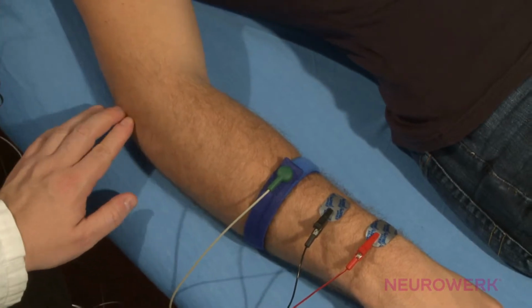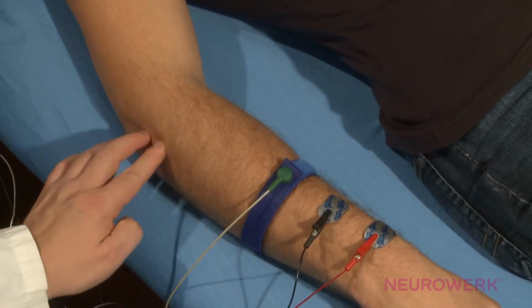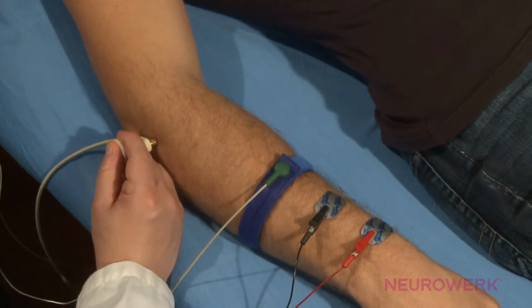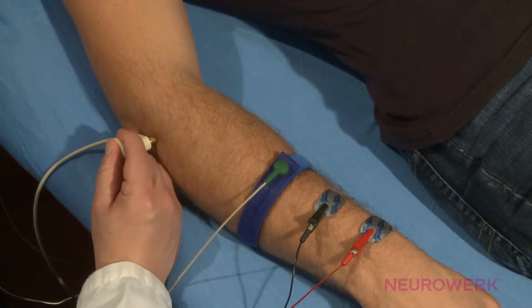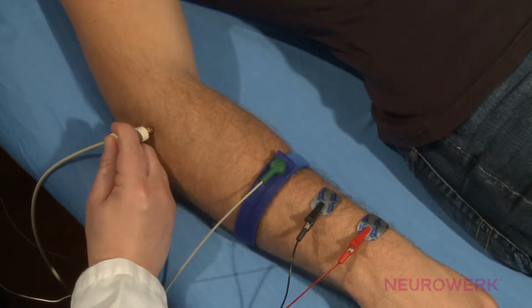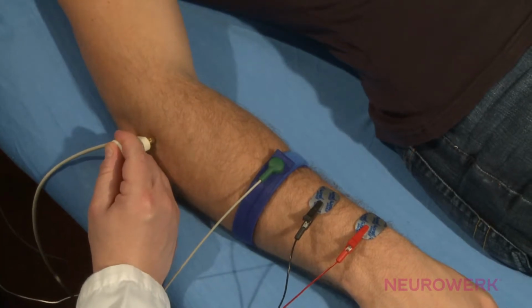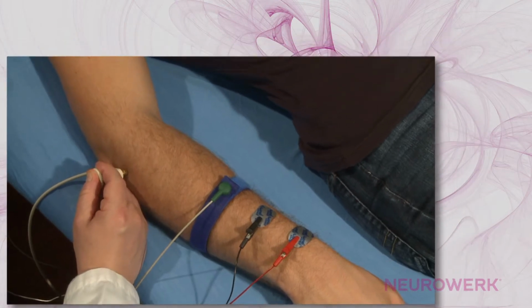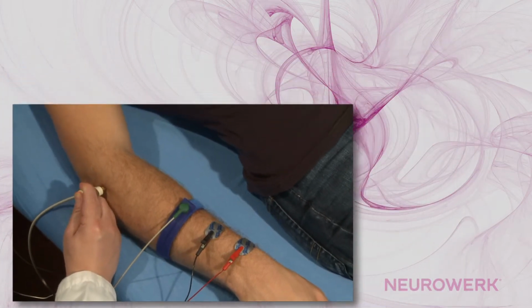Initially, the distal stimulation of the radial nerve takes place on the lateral antecubital fossa, medially to the brachioradialis. In this instance, you might have to search for a while longer, as the nerve is located below the muscle. Frequently, a strong pushing on the nerves and the prolongation of the stimulus impulse to 500 microseconds may help matters.